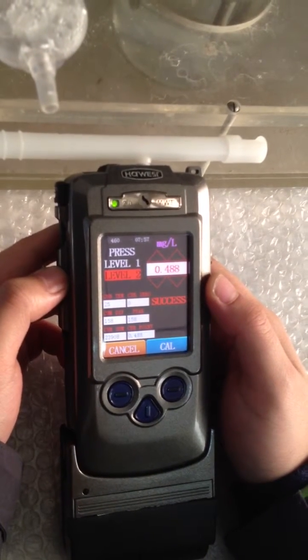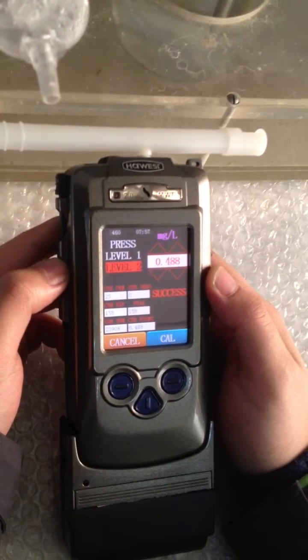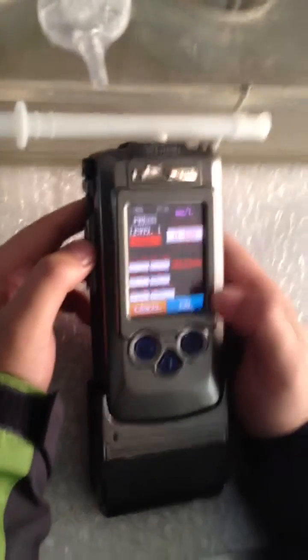Success. The second point of calibration is also successful. The pressure calibration and the alcohol calibration are all finished. Thank you.